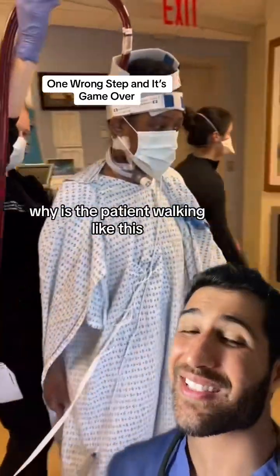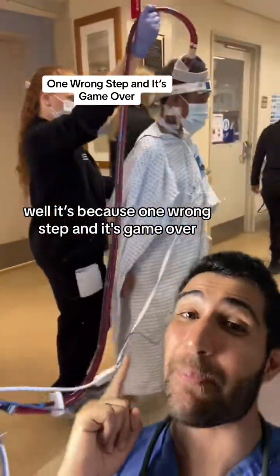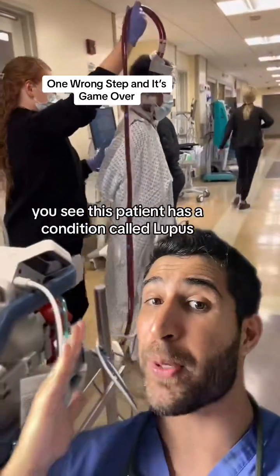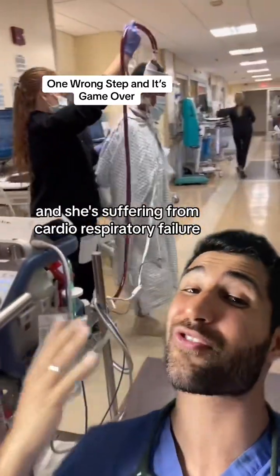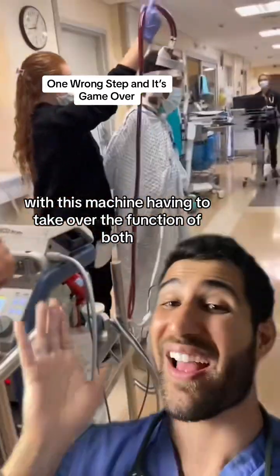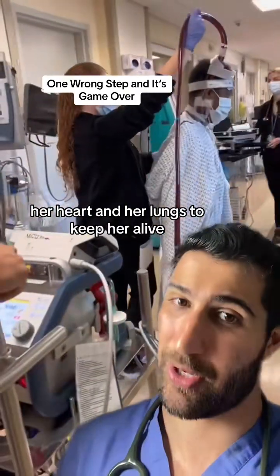Why is the patient walking like this? Well, it's because one wrong step and it's game over. This patient has a condition called lupus and she's suffering from cardiorespiratory failure, with this machine having to take over the function of both her heart and her lungs to keep her alive.